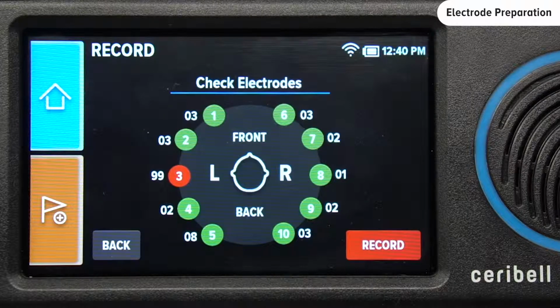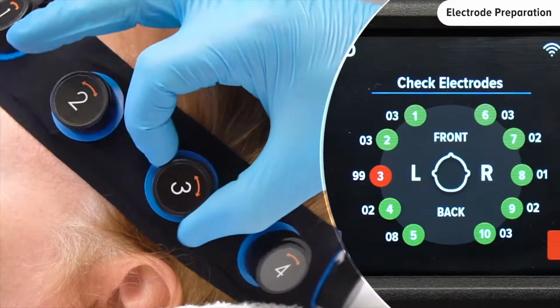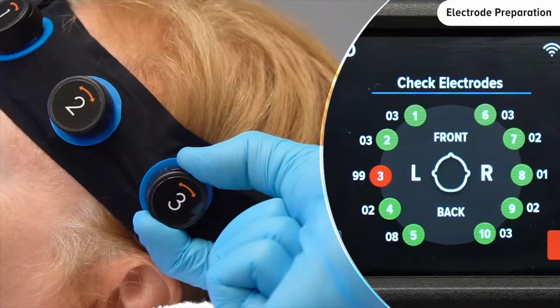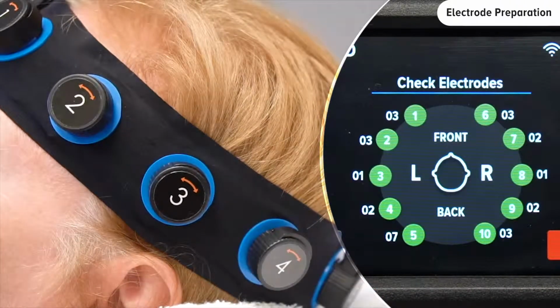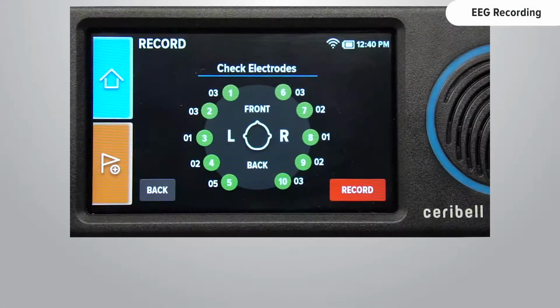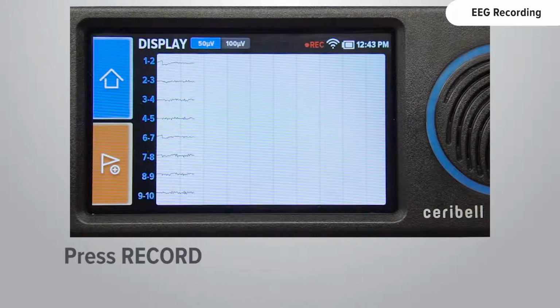In this case, electrode 3 still has a poor connection and is displayed in red, while all the other electrodes are properly set up. To fix it, rotate electrode 3 5 more complete rotations and then squeeze the plunger further to dispense any remaining electrode gel. With all electrodes in green, touch the Record button to begin recording.